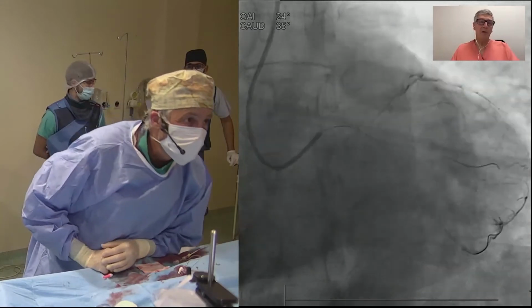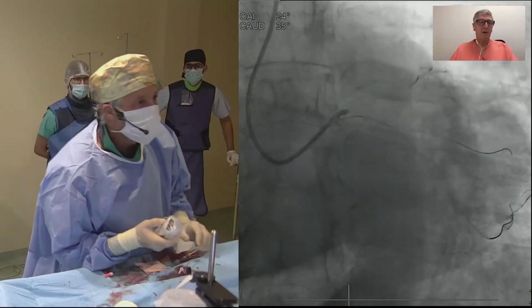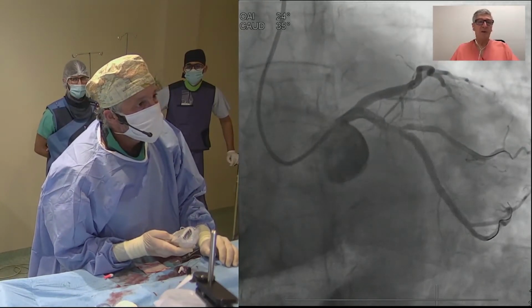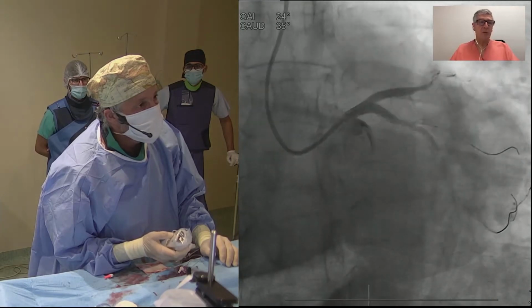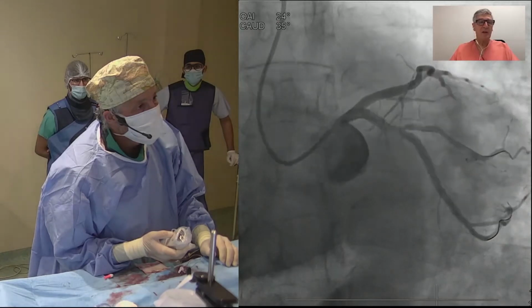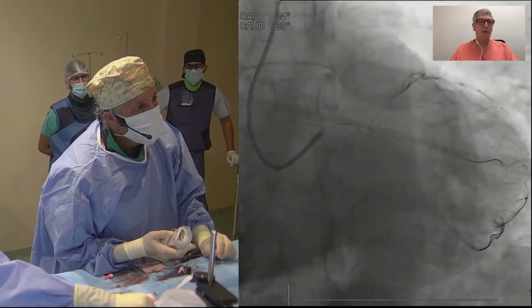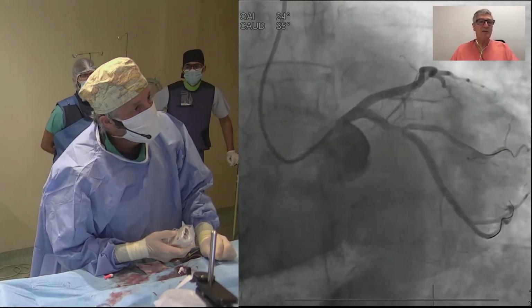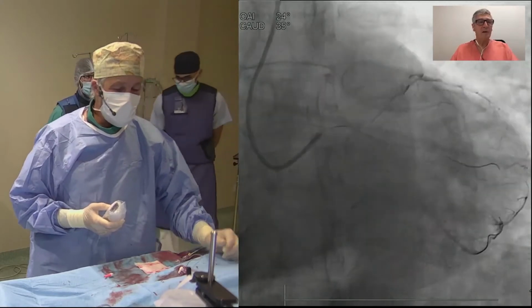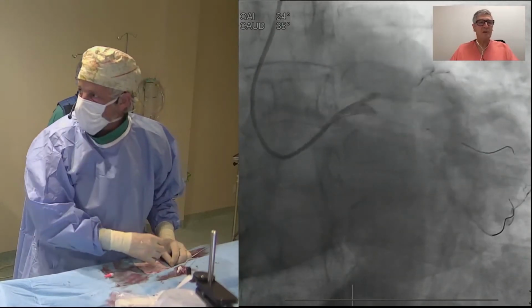And in many cases, I'm not doing pre-dilatation because when the patient is unstable, usually it's a soft plaque. But if I do pre-dilatation, I use a small balloon. Exactly. Smaller than the reference. What is interesting after pre-dilatation is that the proximal part of the vessel looks bigger than 3.7. The QCA showed 3.7 and 3.5 for the proximal and distal reference, but it looks close to 4, in fact. Yes, it looks larger.